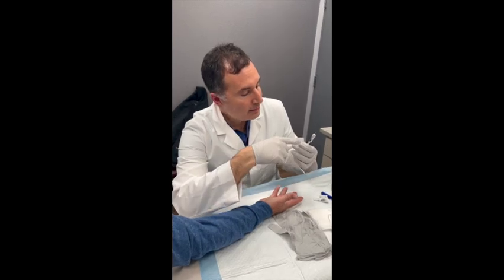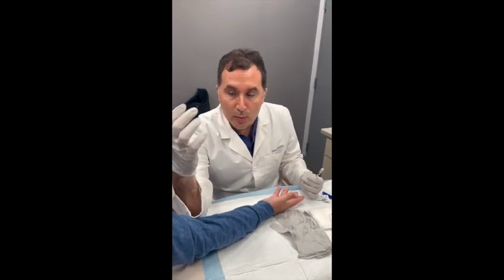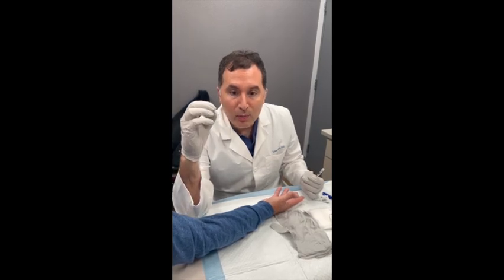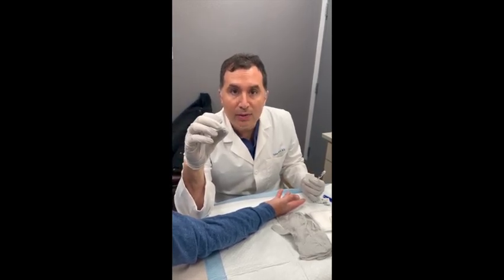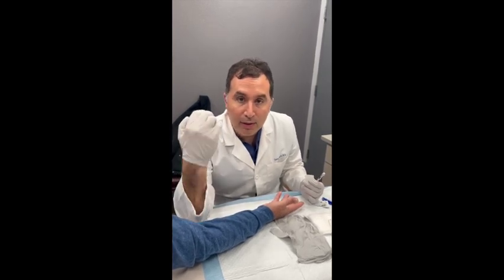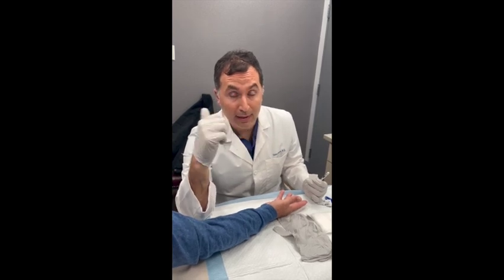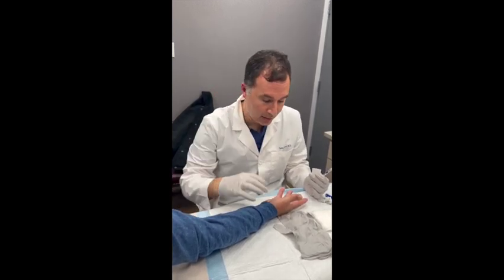Xiaflex is a medication that we can inject into the Dupuytren's cord — that abnormal tissue that's pulling on the finger — and we let it work over 48 to 72 hours. We bring the patient back at that point and then we can pull on their finger and rupture the cord. We were successful in doing that on the left side. The patient's now back for his right hand.